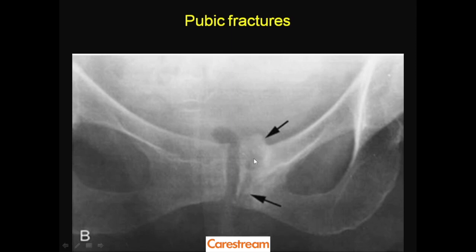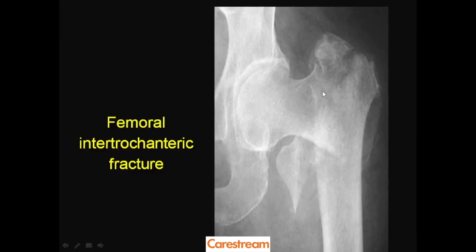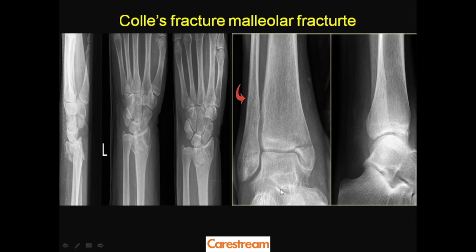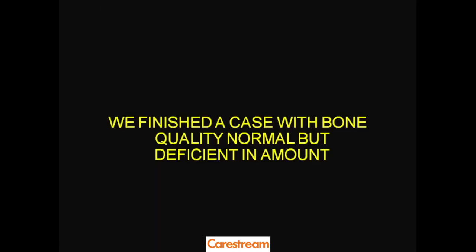Here is a vertical fracture with callus formation in the pubic bone. In certain cases of osteoporosis there is gradual loss of femoral head sphericity, and if AVN has developed due to steroids, there is finally collapse and secondary degenerative changes. A through-and-through femoral intertrochanteric fracture is very common in osteoporotic patients. Other common fractures in the osteoporotic profile include Colles' fracture of the distal radius, bimalleolar fracture, and spine fractures. On CT, the osteoporotic spine shows trabecular prominence and cortical thinning with wedge fractures; MRI shows biconcave vertebral bodies and vertebral plana.